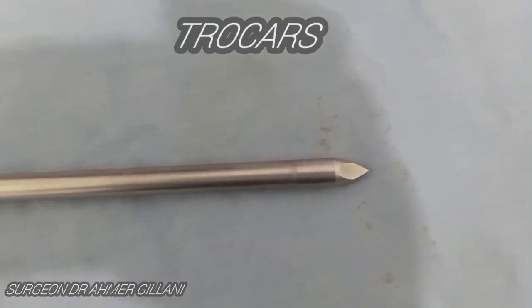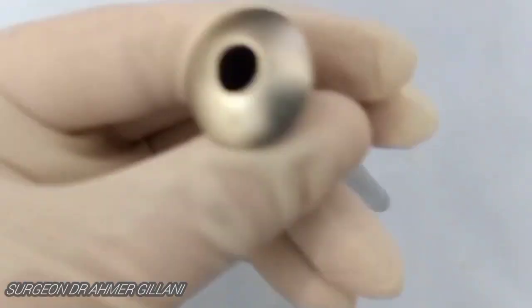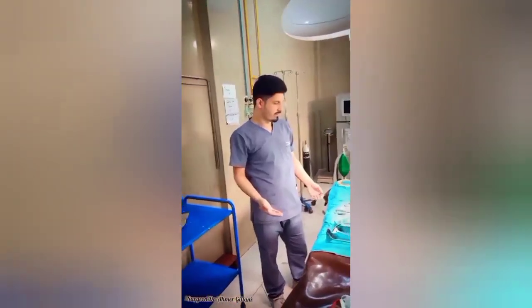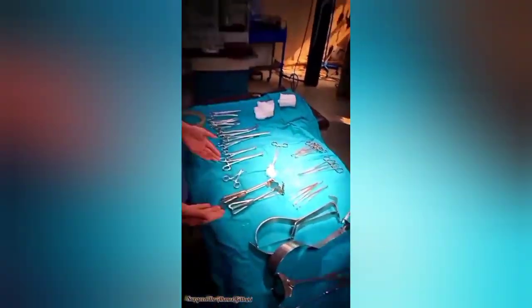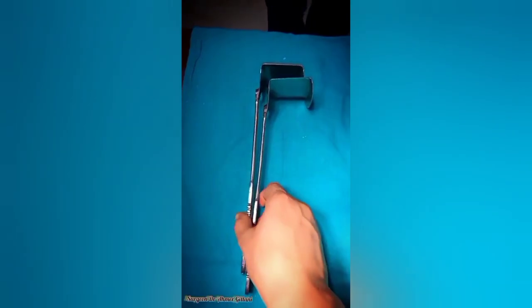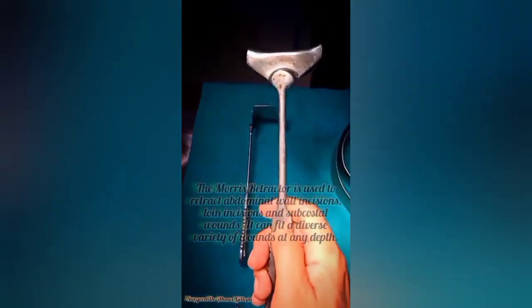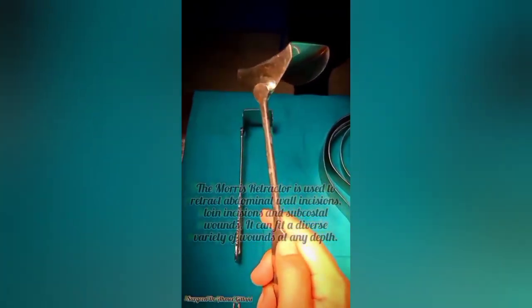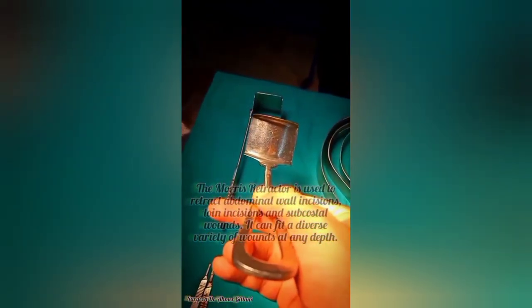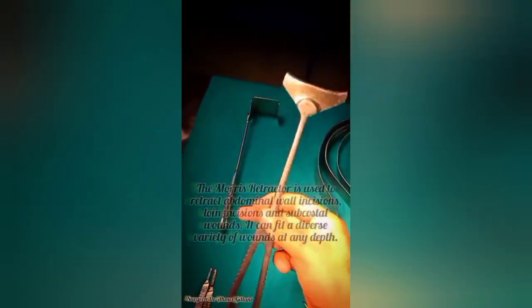Now we are going to demonstrate two different sets of instruments used in laparotomy, which are the most commonly used instruments. We will discuss them one by one — their names and uses. The first instrument on the screen is the Morris retractor. It is used by surgeons and gynecologists when working in the deep layers of the patient, particularly when abdominal incisions are made and closed.